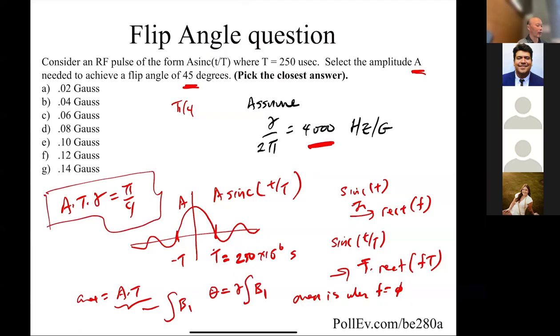We'll pick it up next time. That's just an example of things that go on all the time. The cool thing about this is that the sinc function is not picked randomly. Right now, if you go to almost any MRI system in the world, it's playing out these sinc functions or some example of sinc functions. These sinc functions are prevalent. If you go down into the depths of any MRI code, it's doing calculations exactly like this. What you're going to learn in this course is the calculations that are actually done in practice. And if you put a scope onto an MRI system and look at the RF, you'll see sinc functions.